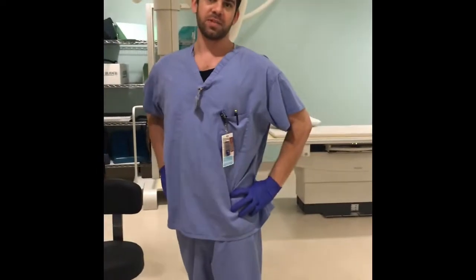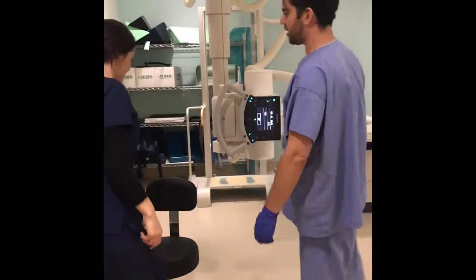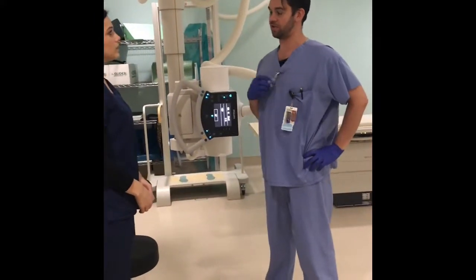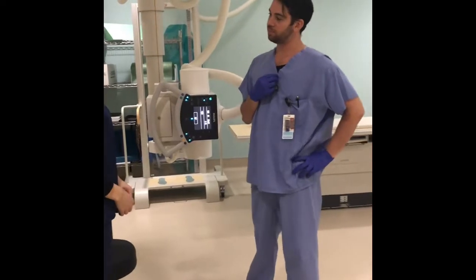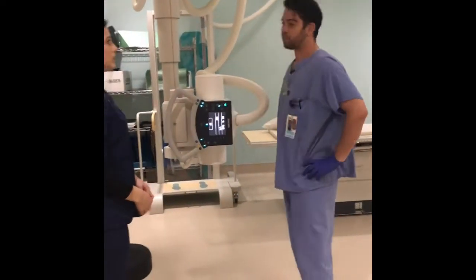All right, now that our room's set up, I'm going to go get our patient. Madeline? Yes. Hi, my name's Jesse. Hi. I'm a student with the radiography program, and I'm going to be doing your sinus x-rays today. Okay. Can I get your full name? Madeline Ortiz. And your date of birth? 11/23/93. Any chance of pregnancy?